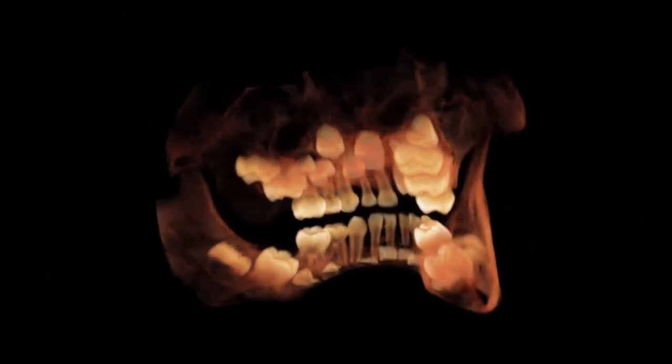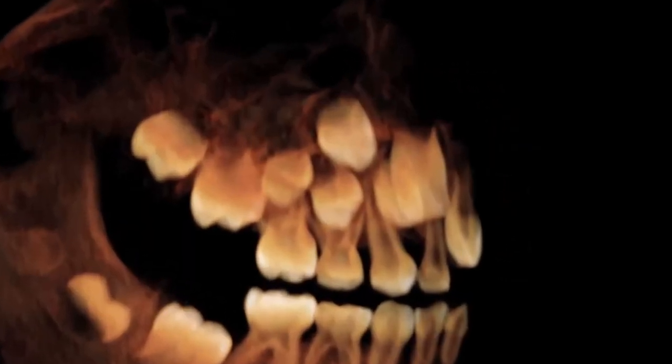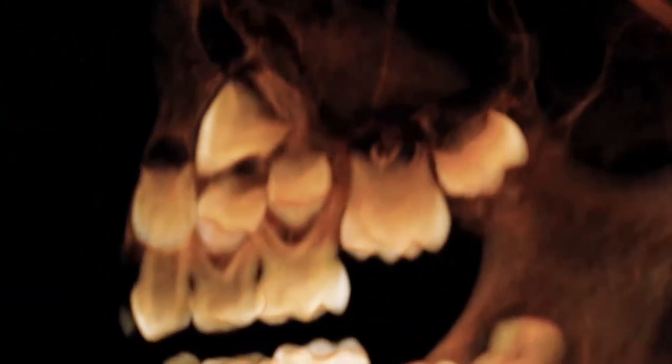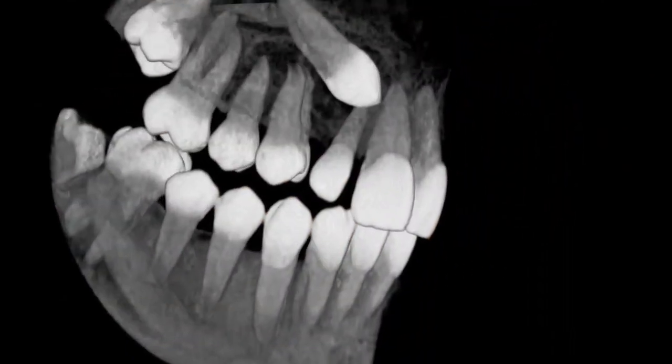The 11 cm field of view captures the entire adult dentition and provides a lower dose than the 15 cm field of view. The field of view may be shifted to frame the temporomandibular joints. The 7 cm field of view uses a high-resolution collimation system to further focus into smaller anatomical regions with the highest resolution.